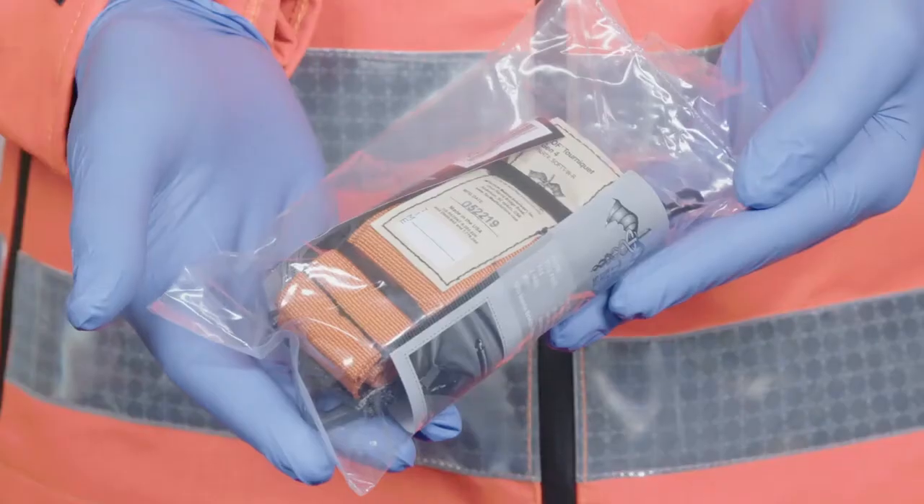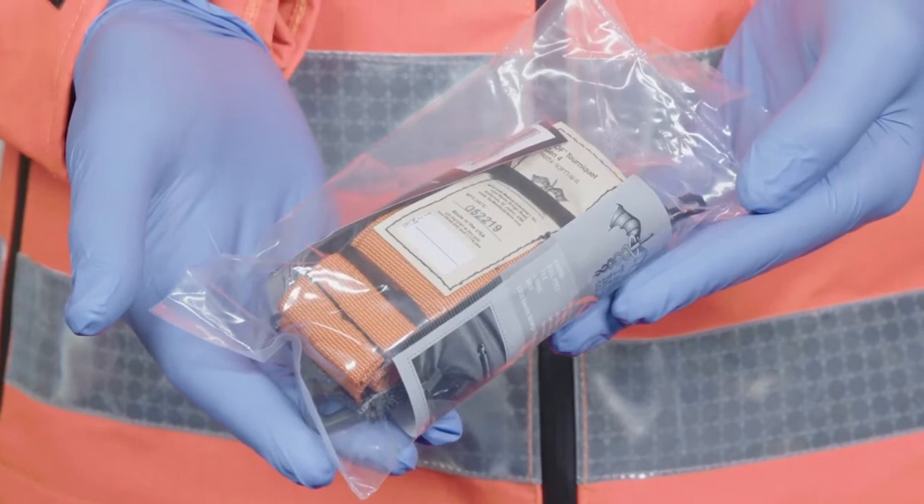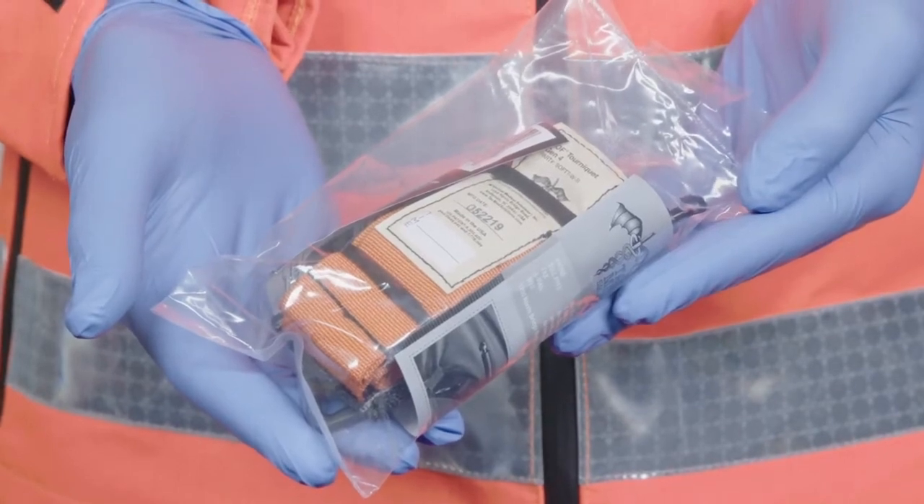I'm Dr. Richard Lyon and in this video I'm going to demonstrate how to use the latest generation of the soft tactical tourniquet wide, often called the soft T or soft TW. This device is designed to be used on patients with severe bleeding of an extremity, resulting in effective management of the bleed until a patient can receive definitive care.